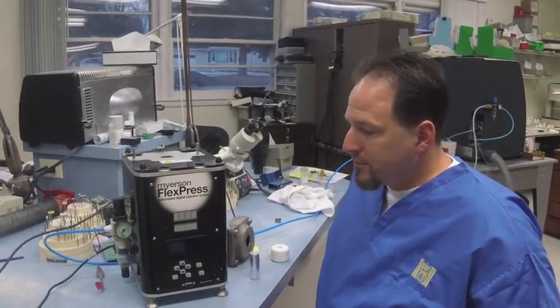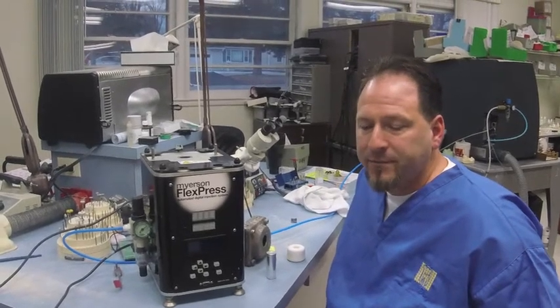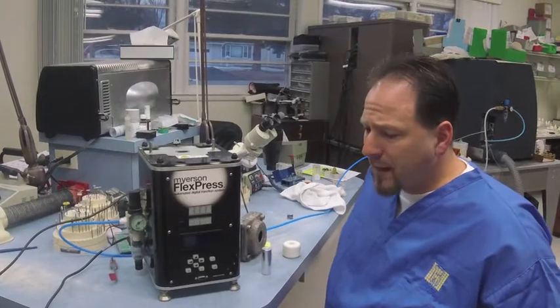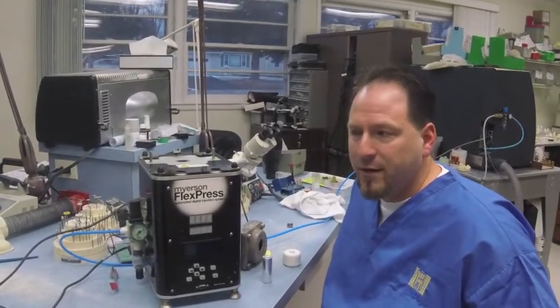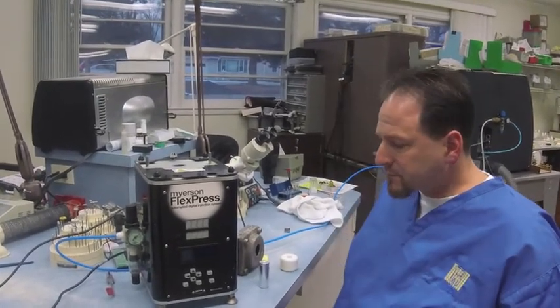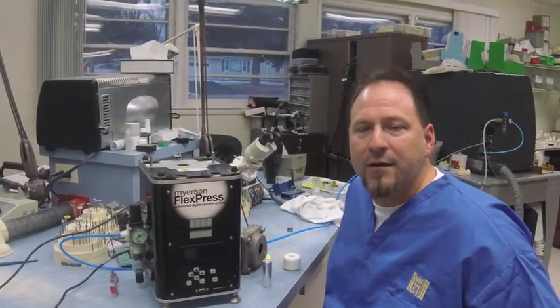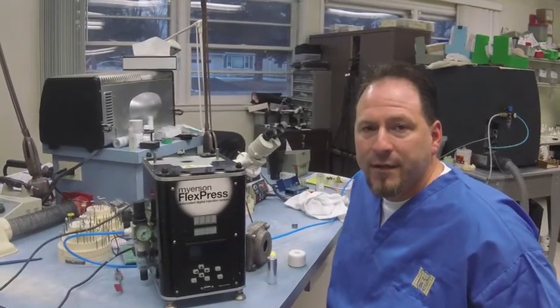The first thing when you unpackage it, you're going to need to hook it up to a regular electrical outlet — 110 is fine. You're also going to hook it up to compressed air. I'd like to see at least 100 psi. A little more is not going to hurt — I have mine at about 115. Sometimes other pieces of equipment can steal a little air from the machine, so having a little bit more isn't going to hurt anything.